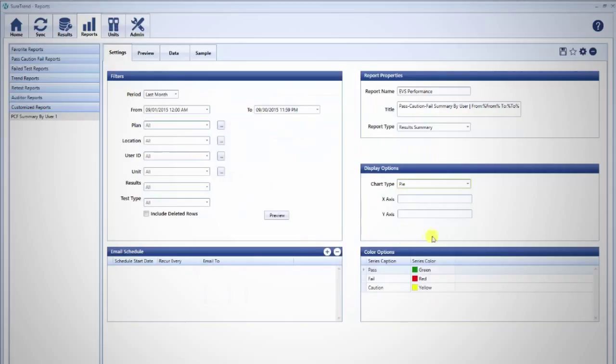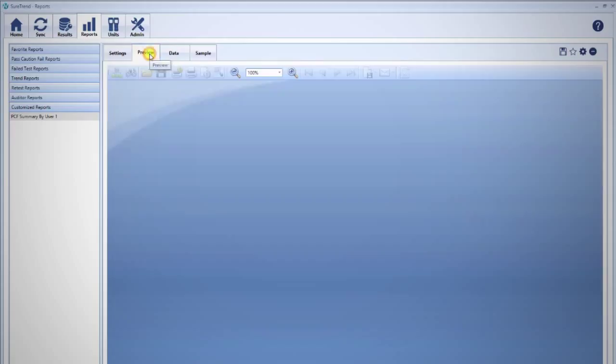Once you've set all your preferences, click the disk icon on the top right to save the report. At any time, you can preview the report you are working on by clicking on the Preview tab.